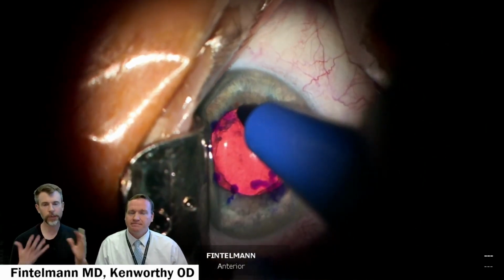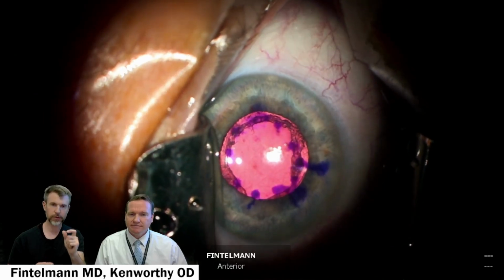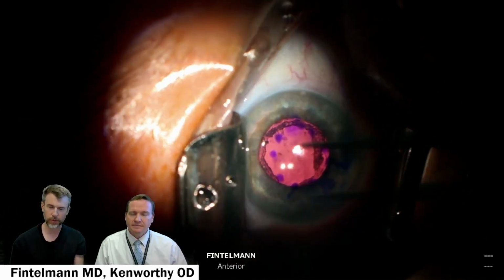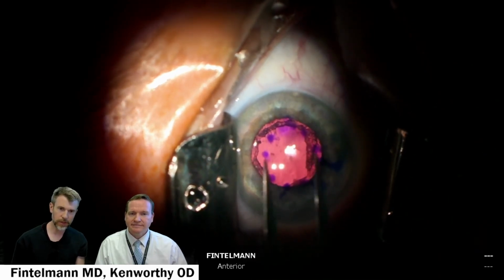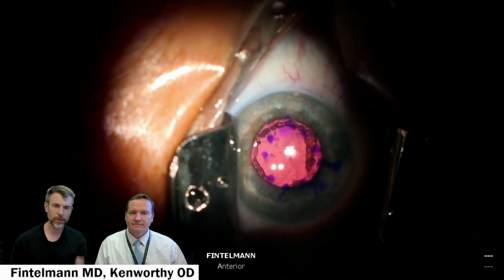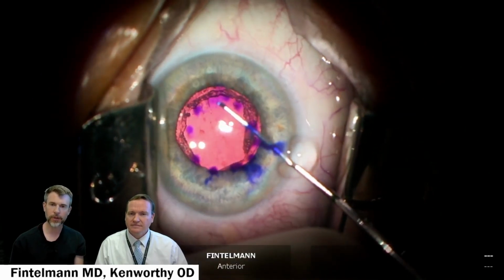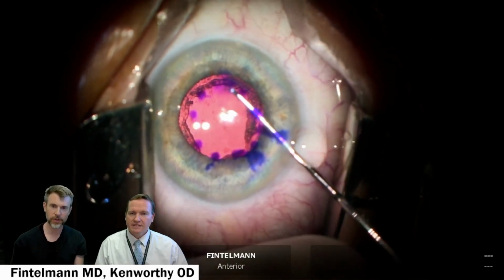And it's fairly new, so we don't know the long-term outcomes, but it turns out that less than 5 millimeters centrally can be removed safely with a pretty fast recovery. As you saw, this was 3.5. This is still adequate in this size, and this is about the same. Little oval. I tend to not be very picky if it's round or oval, as long as I have a nice diameter that can still remove the glare portion or the symptoms causing portion.